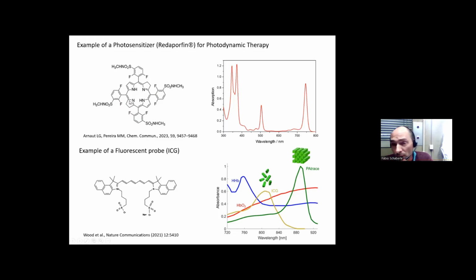In the production of singlet oxygen or reactive oxygen species, of course, you have some collateral or side effect, but it's not too relevant, because photoacoustic tomography, in general, does not take too much time to collect an image.